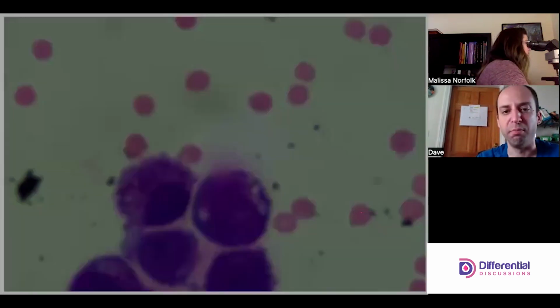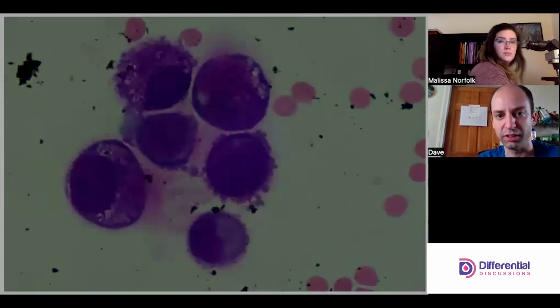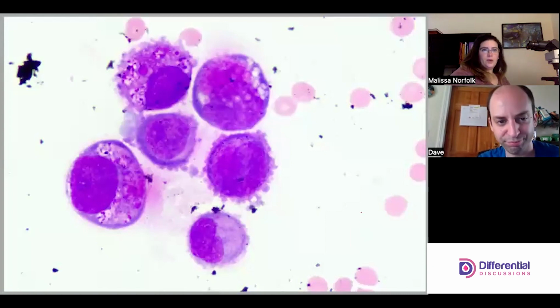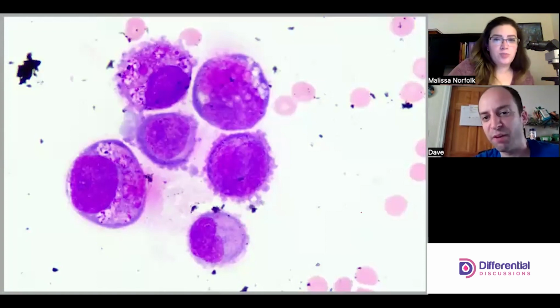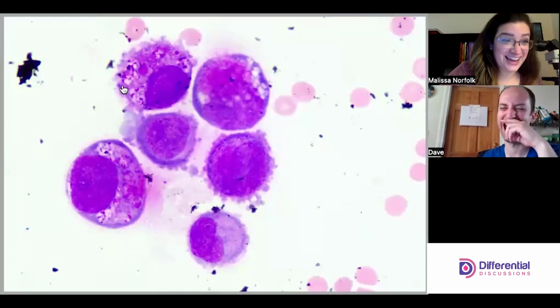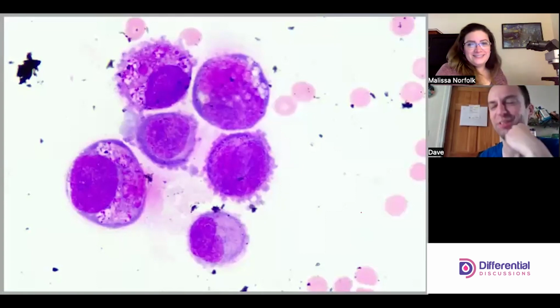Large cells in the CSF, monocytes and macrophages, are totally accepted and frequently seen. But these six cells take up almost the entire field. Great perspective. These could be promyelocytes. Look at those granules. I take your point, promyelocytes certainly do have granules.